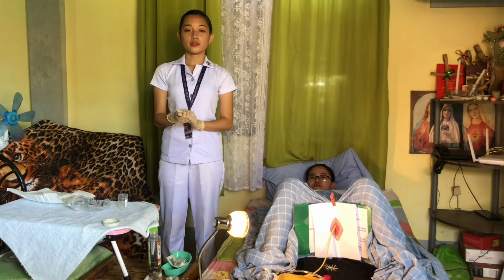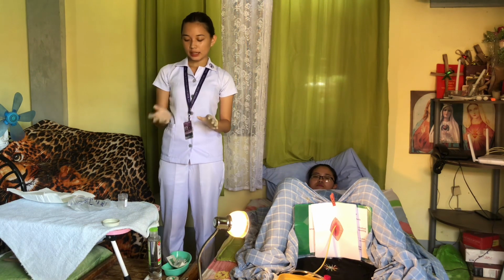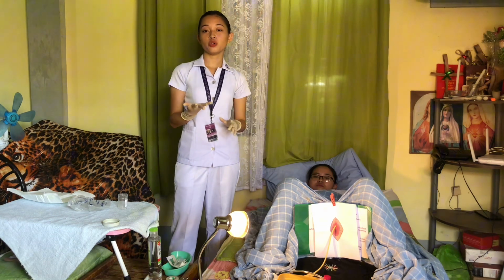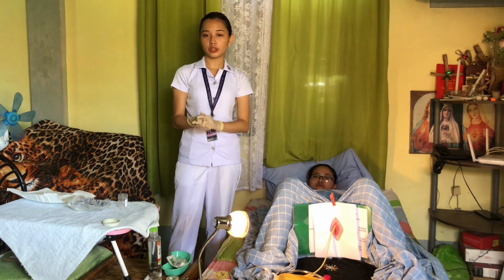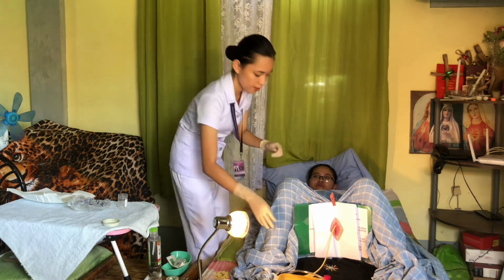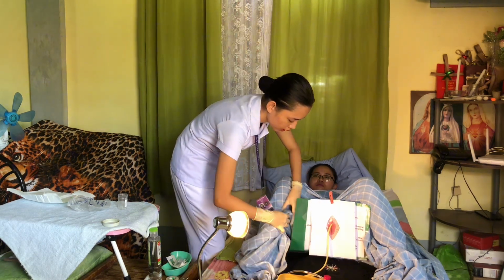So now I'm going to secure the indwelling catheter by taping the catheter on the patient's thigh. So a female's thigh is known to be the best area to tape the catheter, and for males it is the abdomen.